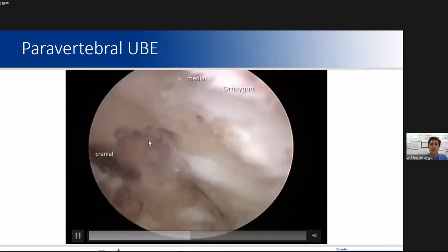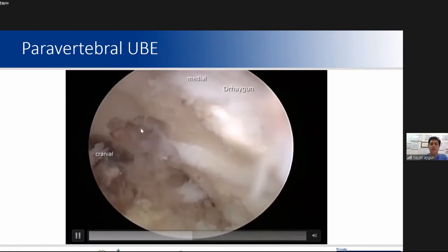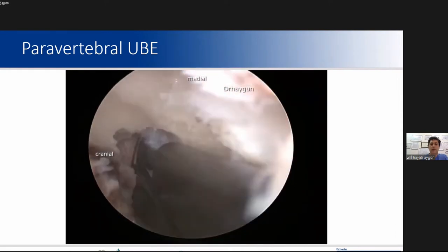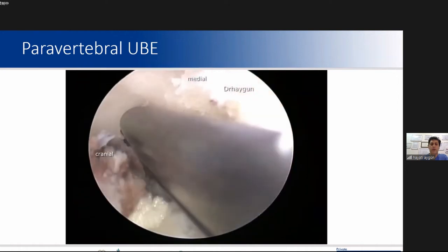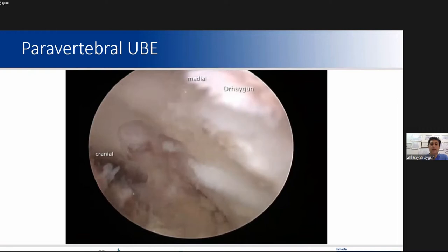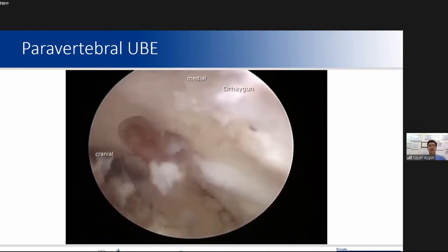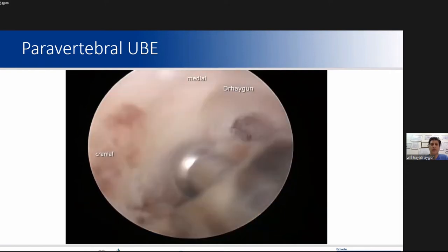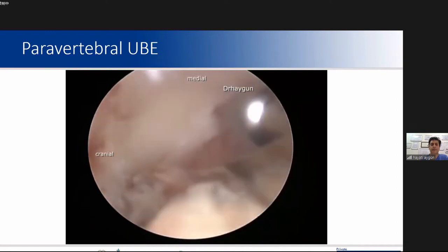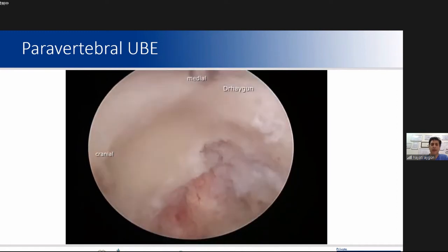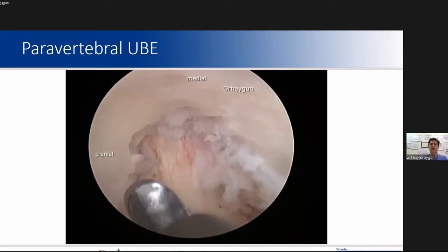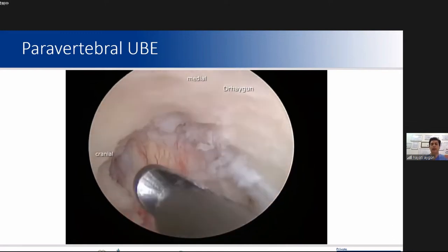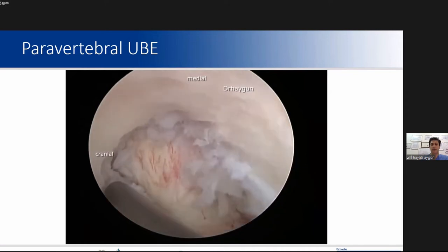Now the flavum is exposed — the lateral edge of the flavum is exposed. The foramen and foraminal entry are being widened with the Kerrison punch and drill. I go step by step to achieve enough osteotomy while preventing instability of the joint.